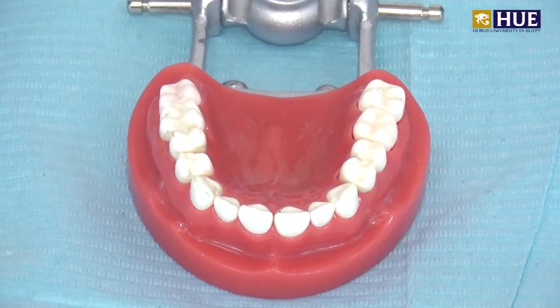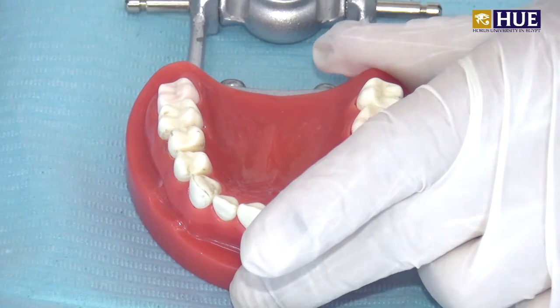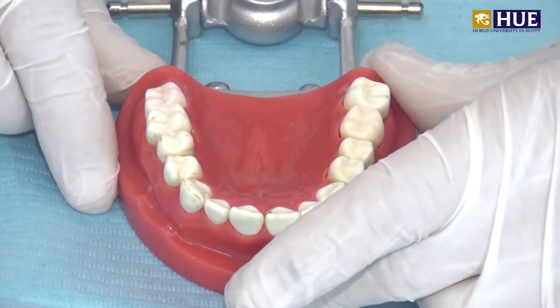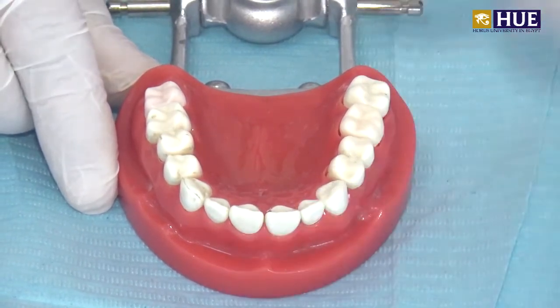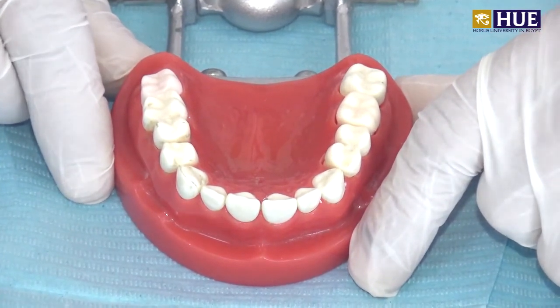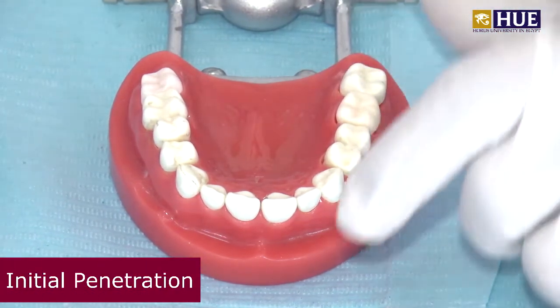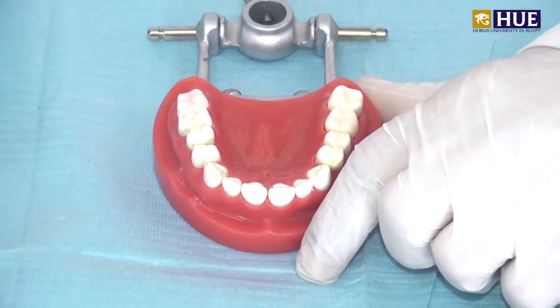This is the expected outline form for the conventional design of class 3 cavity, which you call the GV Black design, which in the past was filled with amalgam restorations, because at that time the only material available was amalgam. So GV Black used this design, the conventional design with all margins in enamel, for amalgam restorations.